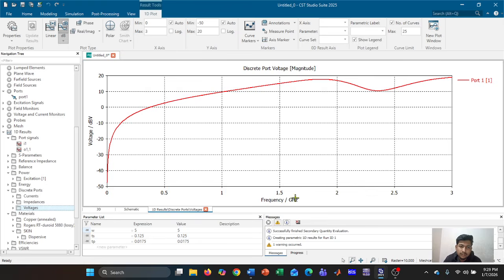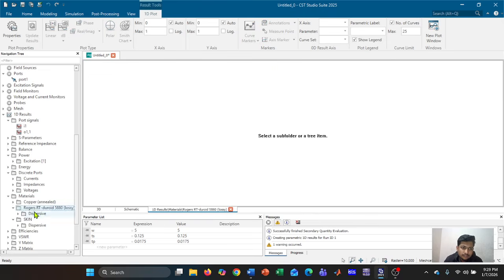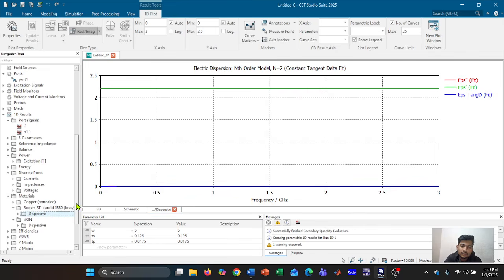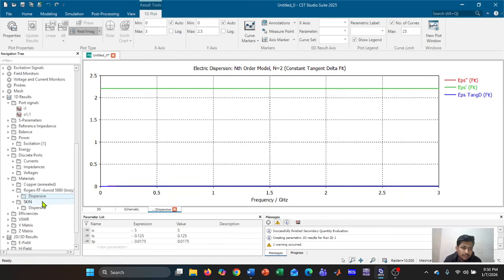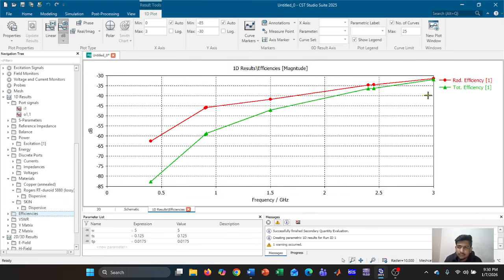This is frequency domain. If we see the lossy material, this graph compares real material behavior with simulated results. Both graphs match very well. Epsilon fit, tangent fit. And this is the efficiency curve.